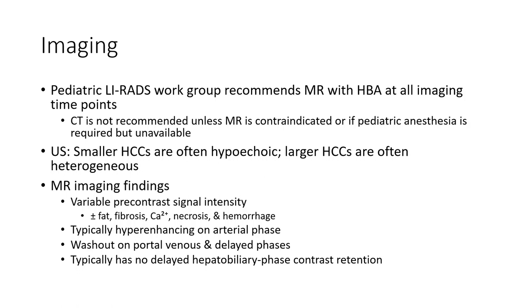On ultrasound, smaller HCCs are often hypoechoic, while large HCCs are often heterogeneous. These are compared with imaging findings on MRI.